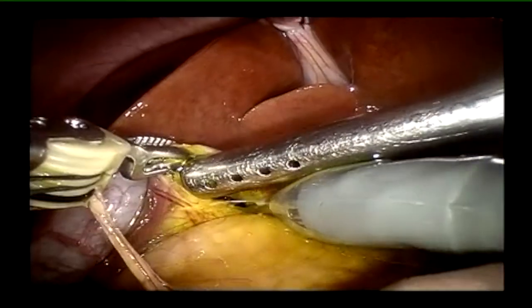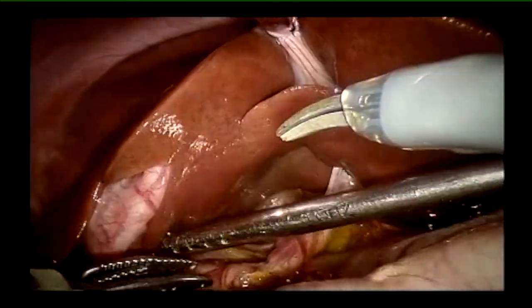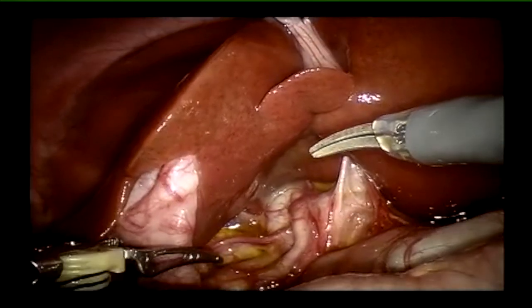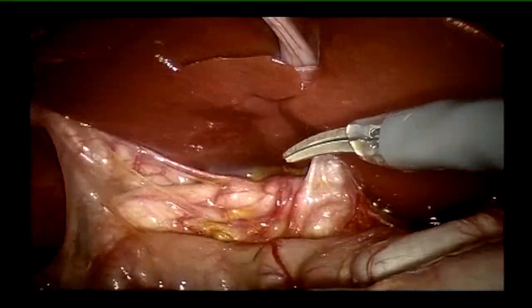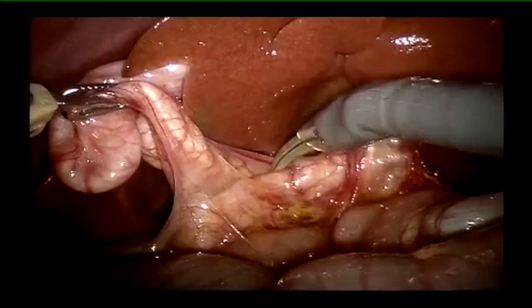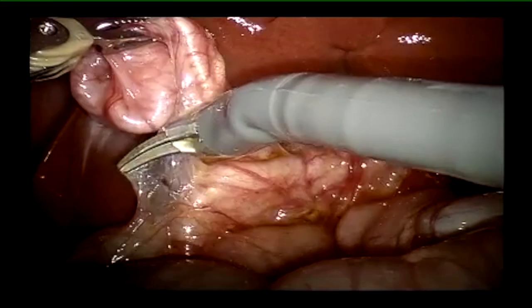Is it safe to operate on such small kids? He is barely 3.2 kg. I think it is actually safer to operate robotically compared to laparoscopically, because of the flexibility of instruments that is afforded to you.